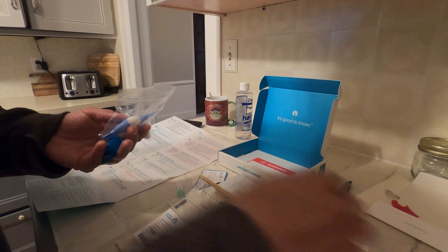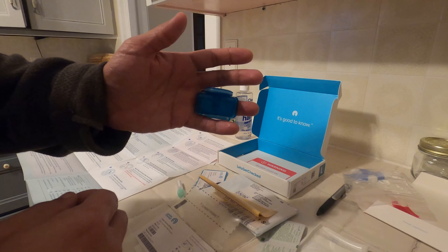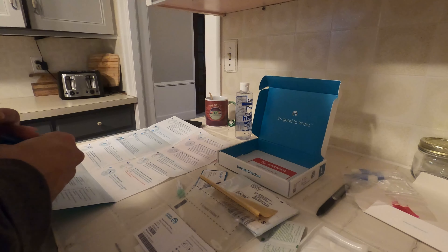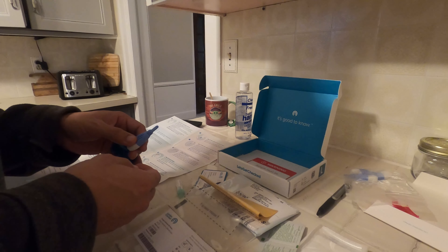After my finger went through the recommended time frame — I believe it was three minutes — I got the lancet out. You can see the device on my finger that helps concentrate blood to the top. That's the lancet I have in my hand.